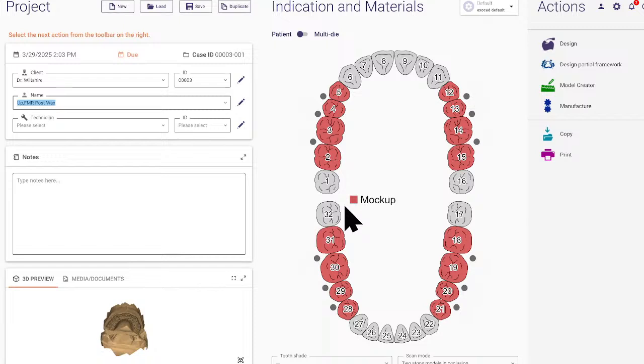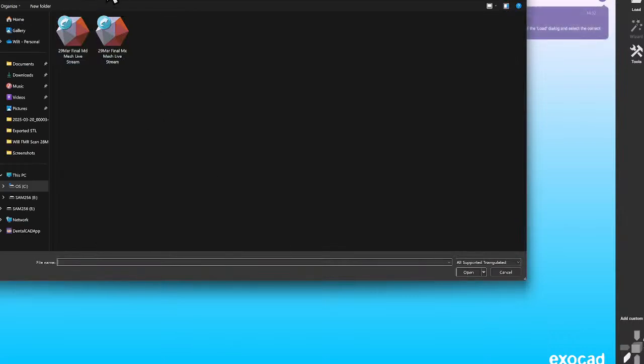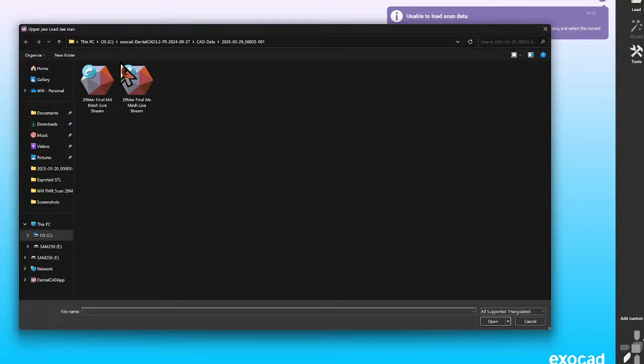Now, once you've selected all the teeth that you're going to be working on, you go ahead and save, open the Explorer, and then you drag your files in. Once that's done, now you go to design. Okay, so there are other ways to do this. That's just the way that I've found that worked for me. You could go to the CAD folder, drag the files over if you want to do it that way. I don't do it that way. I simply set everything up, save, then I go to open an Explorer, and then I drag my two scans, a maxillary and mandibular scan.